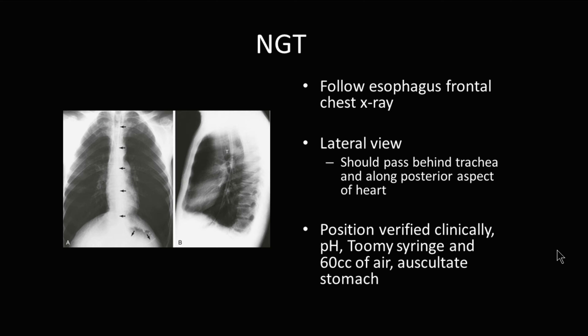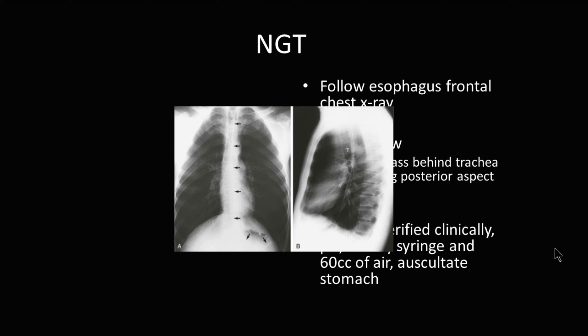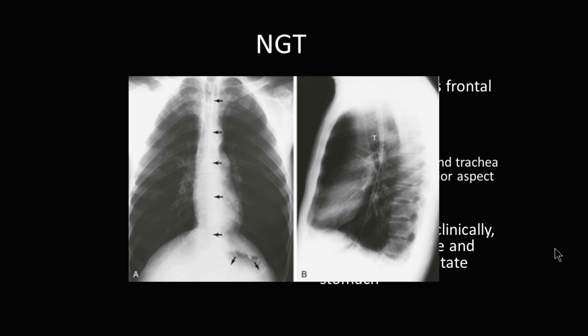Placement of an NG tube can be verified clinically using pH, a Toomey syringe, and auscultation of air into the stomach. However, a chest x-ray can verify placement just as well. You can see here that the NG tube comes down the esophagus and crosses through the lower esophageal sphincter.